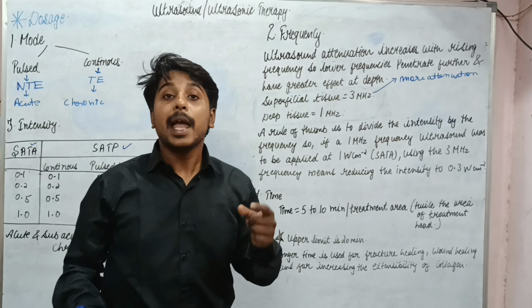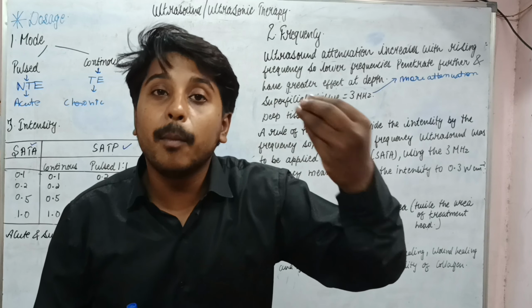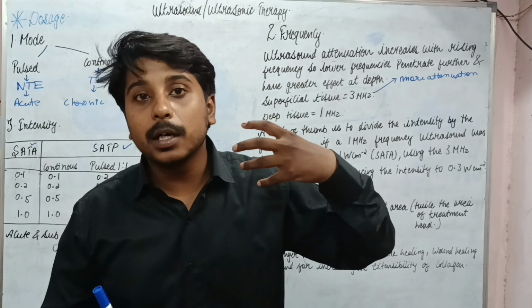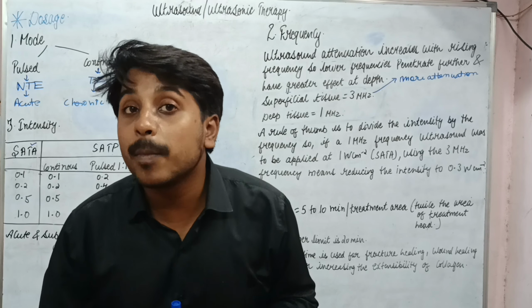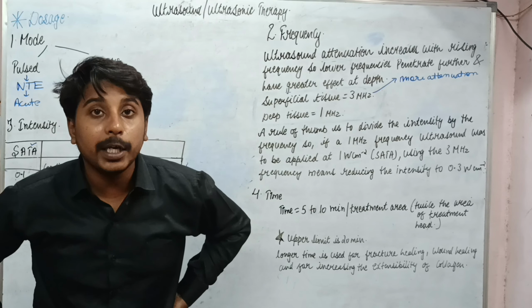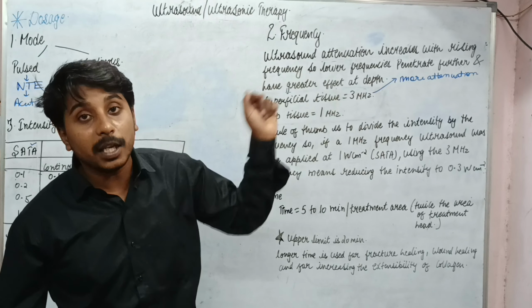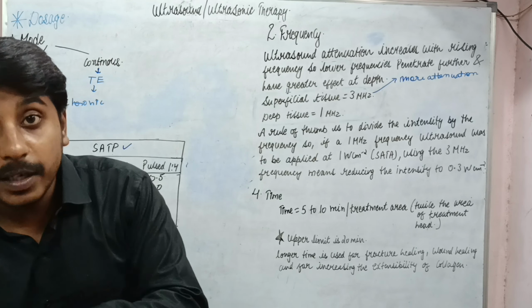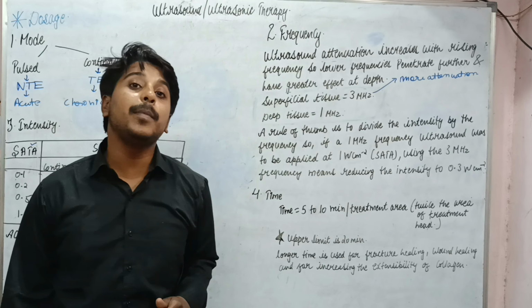Yes, definitely. And among reflection, refraction and absorption, the largest amount of attenuation is produced by absorption. Does ultrasound absorption lead to heating? Yes. So if a lot of attenuation is occurring with 3 megahertz ultrasound, there will definitely be a lot of absorption and heating.